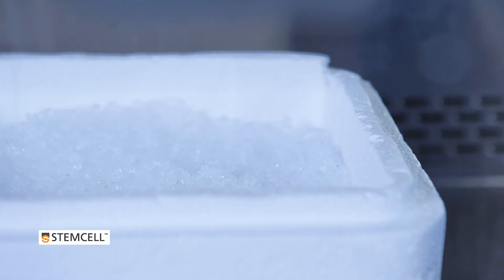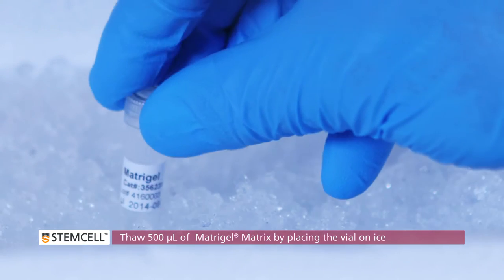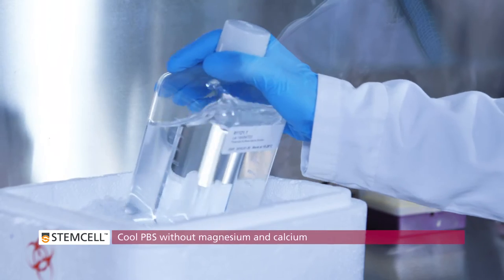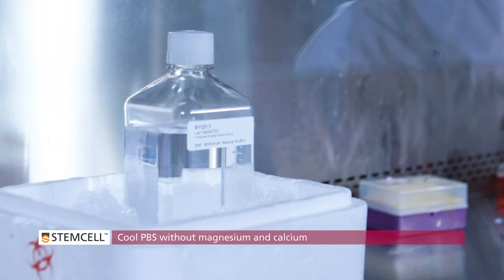Thaw 500 microliters of Matrigel Matrix by placing the vial on ice. We recommend using Growth Factor Reduced and Phenol Red Free Matrigel Matrix, available from Corning Incorporated. Cool PBS without Magnesium and Calcium, as well as DMEM F12, on ice.